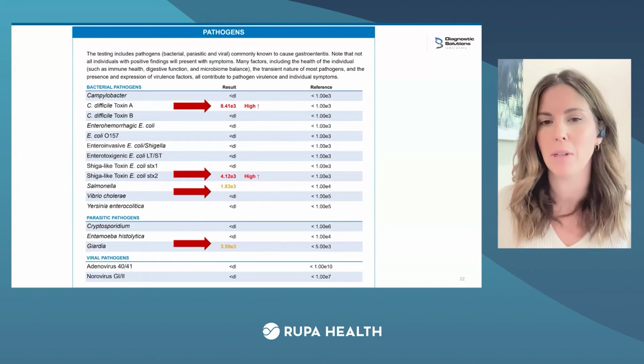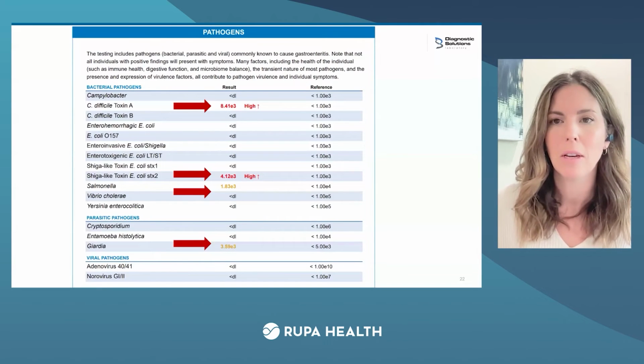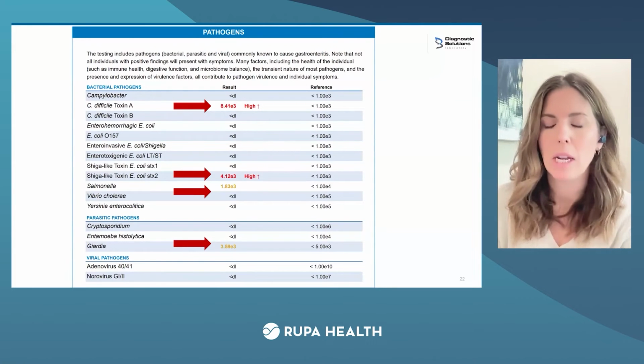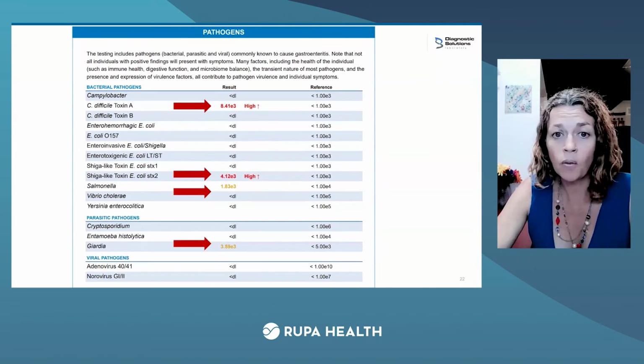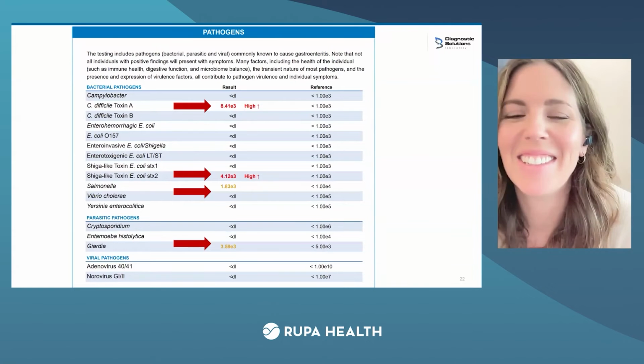So it's not always about the particular organisms present, although some of these might need a bit of a kick out, but we might just need to strengthen or tonify immunity, and work on normal flora and defense systems. And this is not the only thing we're going to find on this GI map, I have a feeling. Spoiler alert. Let's look at the rest.